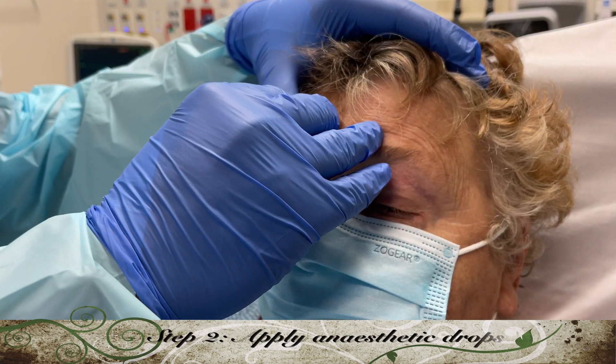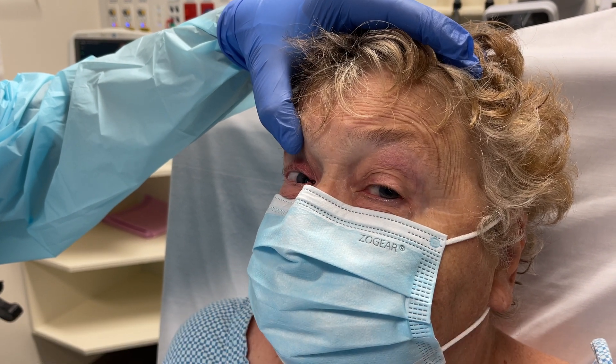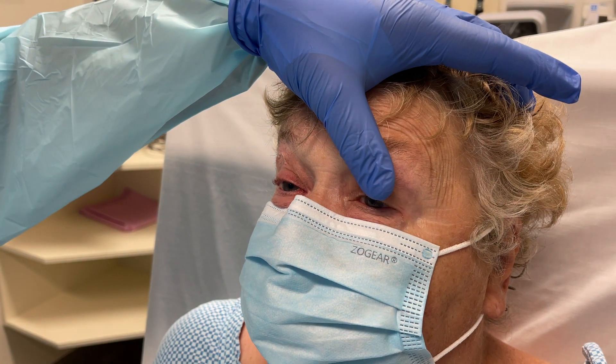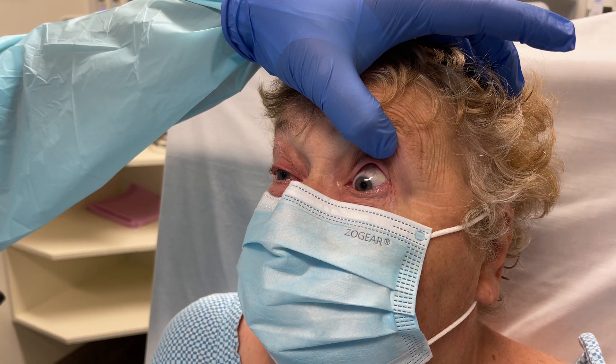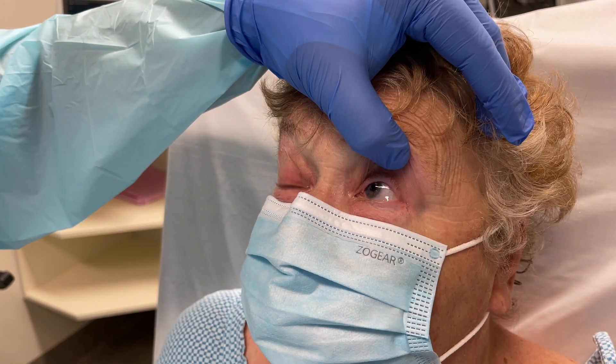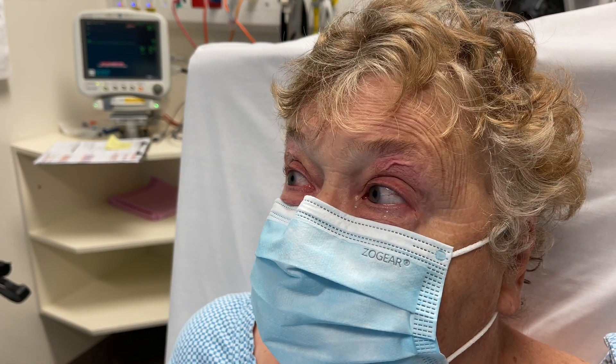Just gently hold the lid up and ask Edith to look down. Apply the drop to the top of the eye. We're going to repeat that on the other side — again Edith will be looking up, down, left, and right just to have that local anesthetic move across her eye.